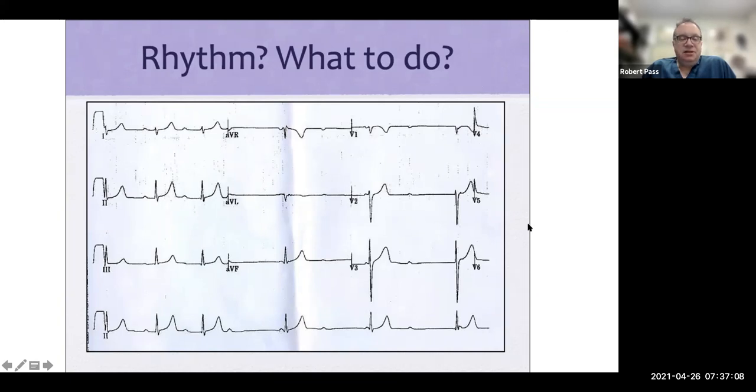In the olden days, we would admit everybody after ablation and monitor them. Let's say this is a WPW patient, and this was seen on the 12 lead in the morning, the pre-discharge EKG. What are you seeing, and anything you need to do about it? Should we just discharge the patient?